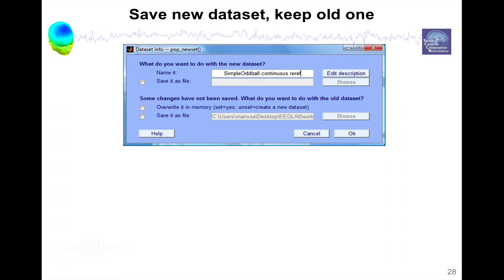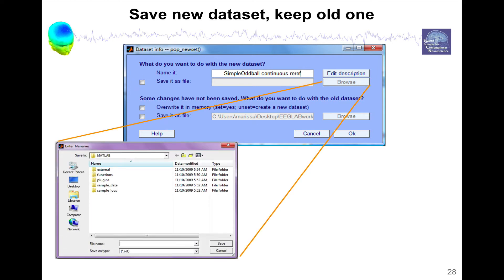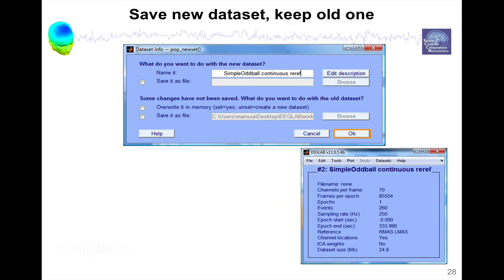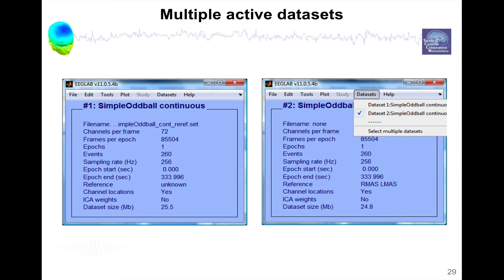When we press OK we get an interface that says this is a new dataset — what do you want to do with it? We can overwrite the parent dataset when you don't have much memory, which is a good option. It's also a good idea to save the dataset as a file by checking that checkbox, entering a file name, and pressing OK. If we didn't select overwrite in memory we'll have two datasets, selectable in the Datasets menu. The first dataset is before referencing, the second is after, and we can see the reference changes from unknown to right mastoid and left mastoid. You can switch between datasets in that menu.